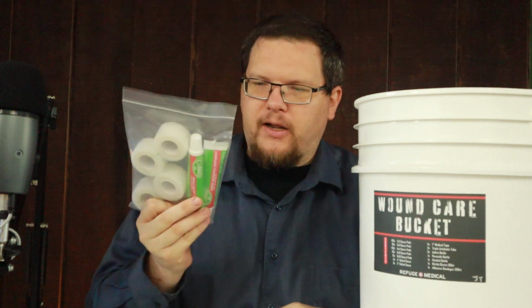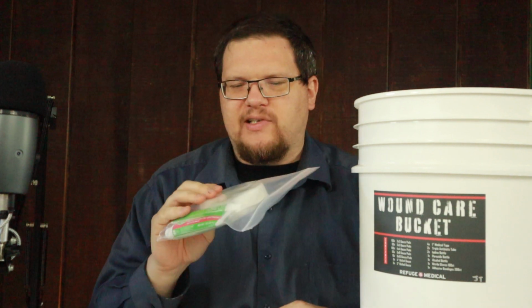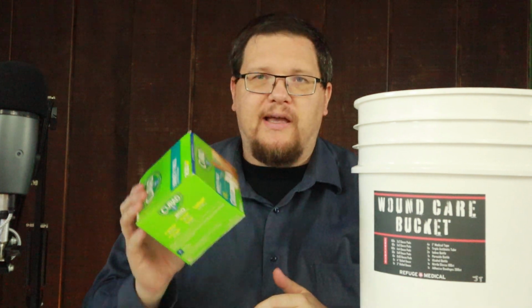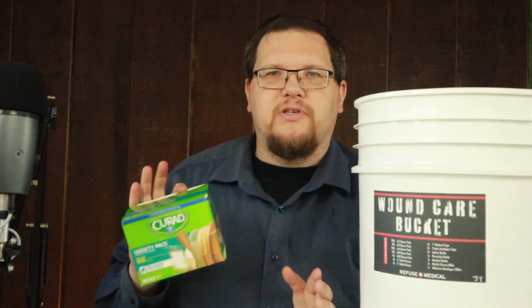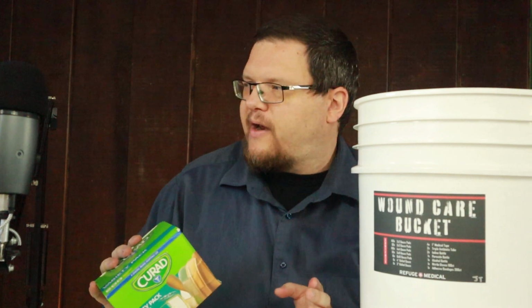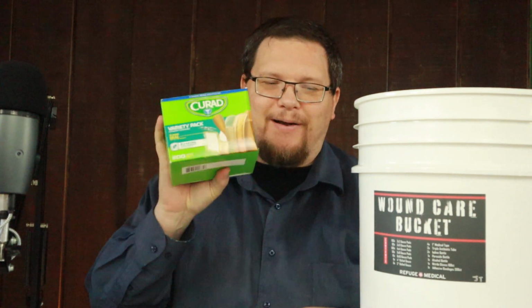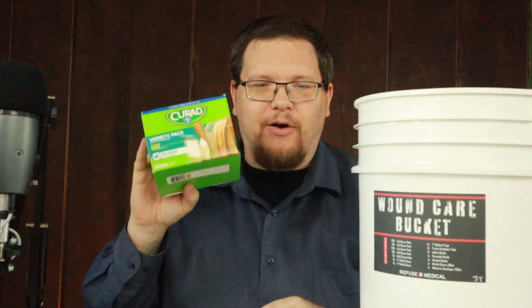In addition to what you have in the bucket, they have a triple antibiotic ointment. Once again, you can pick that stuff up at Walmart. Tape. You need medical tape to hold bandages in place and all that kind of stuff. For boo-boos, any first aid kit that you have, you should have a bunch of Band-Aids on there, because you don't want people using the bigger dressing. If somebody starts taking an 8x10 or 5x7 pad or 5x9 pad and starts using it on a little cut, it's just like, stop! Don't do that. Use a Band-Aid. Come on. Use a 2x2 and a Band-Aid, right? Don't do overkill.